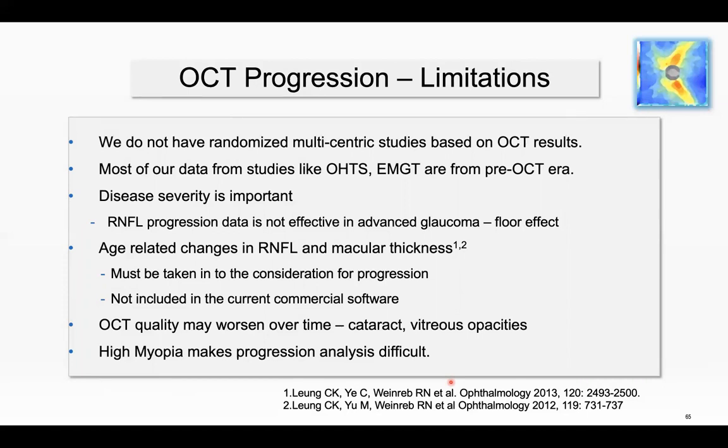OCT quality may worsen over time. Cataract and vitreous opacities affect it. And high myopia makes progression analysis difficult.